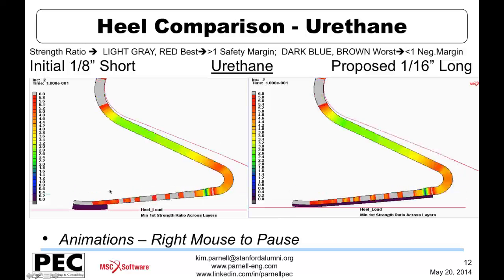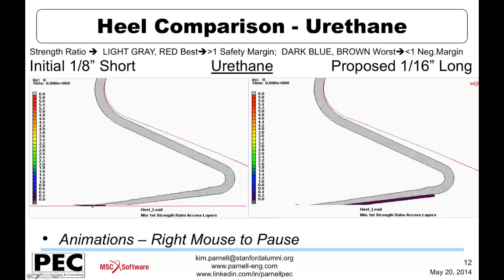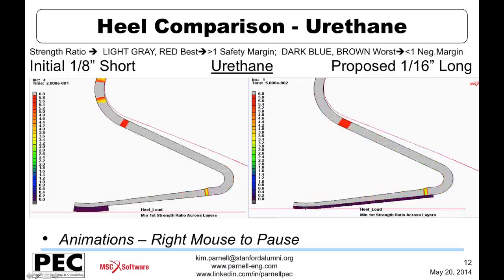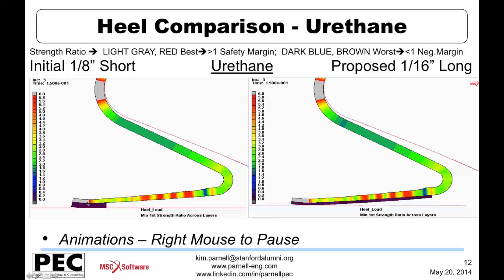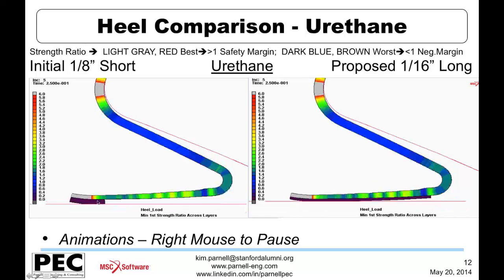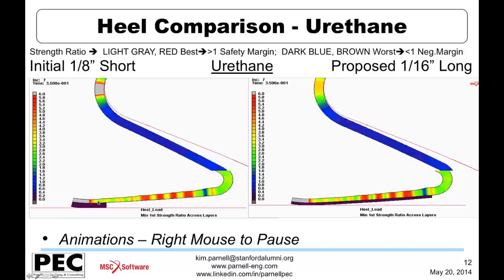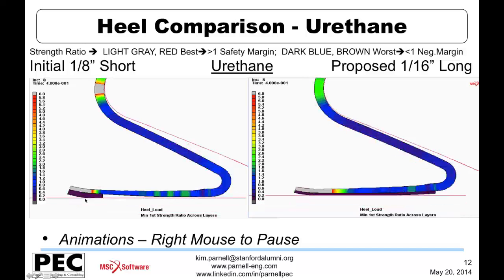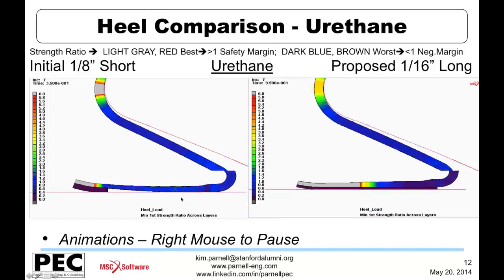So these animations show an overall comparison of the motion and response of the heel and the contact for this short and thicker pad on the left side and the longer and thinner pad on the right side. We'll quantify these a little more, but you can definitely see right away what might be anticipated: that you get more bending and rotation here on the left with the thicker pad, and the loading tends to remain focused closer to the ends of the heel, so that's part of what causes more bending before the ground ultimately makes contact up here with this portion of the heel.